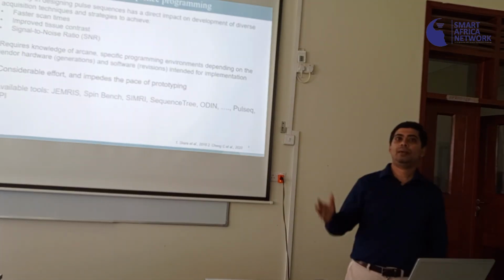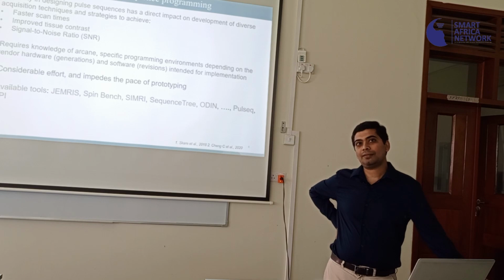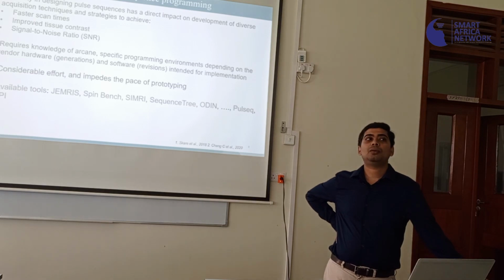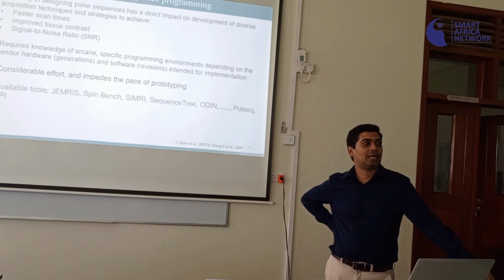On a typical vendor, call them the GPS system, for lack of a better phrase. GPS stands for GE, Philips, Siemens, not necessarily global positioning system in our case. You need to know what is the vendor specific programming environment. Meaning, if you have to program a GE scanner, you need to know EPIC.